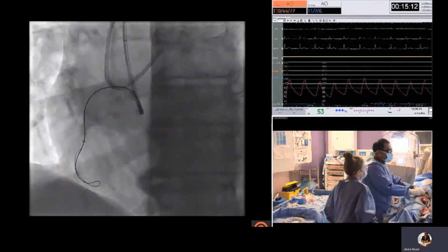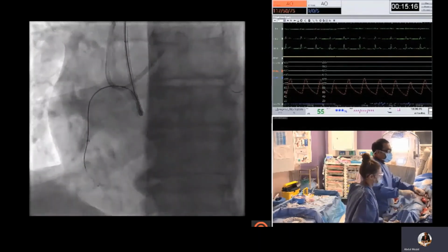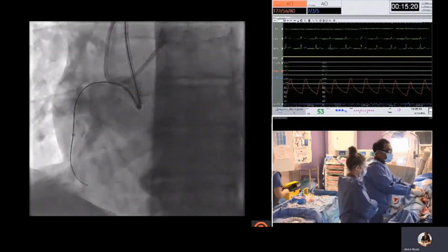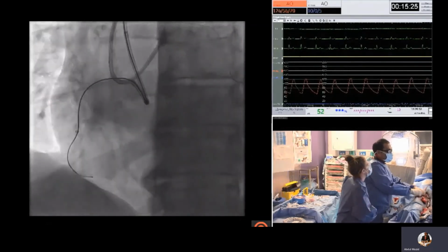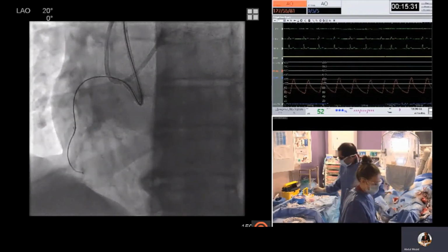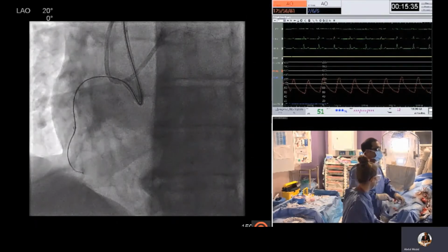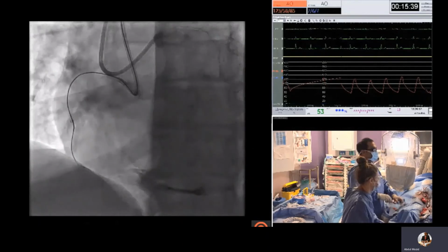So with a Trapliner, it is then easy to introduce and remove devices. So this is a CrossBoss catheter now, and here it is spinning forward to blunt dissect and produce a nicer area for attempted re-entry. You could just try and deliver a Stingray after knuckling.